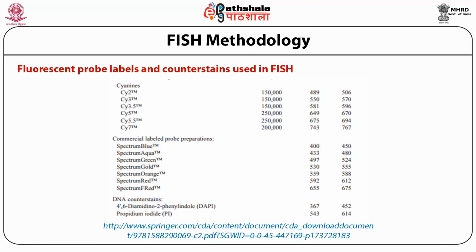For example, DAPI can be used to localize where the entire DNA is. Then we can use a specific probe targeting a specific region of DNA, labeled with either Spectrum Green, Alexa 488, or Cy5.5. In the resulting image which we see under the microscope, we will have a blue background representing the overall nuclear distribution, and then a dot, or two dots, or three dots, depending upon the localization of the DNA molecules and the number of sites we stain with a different color.